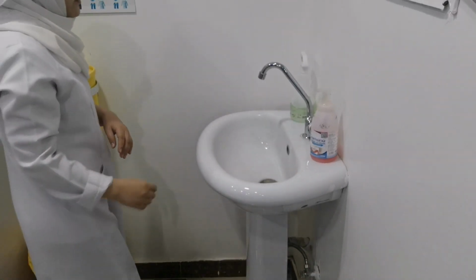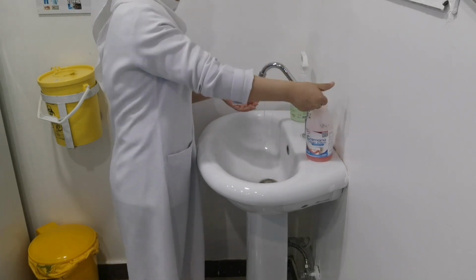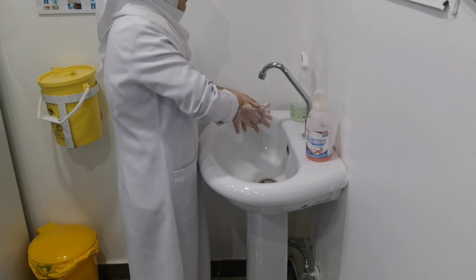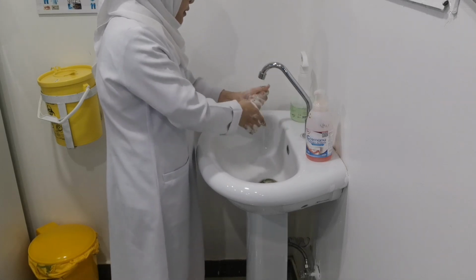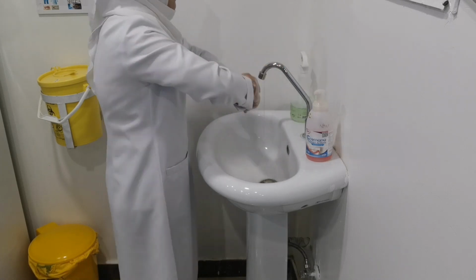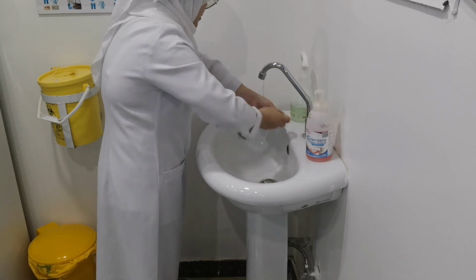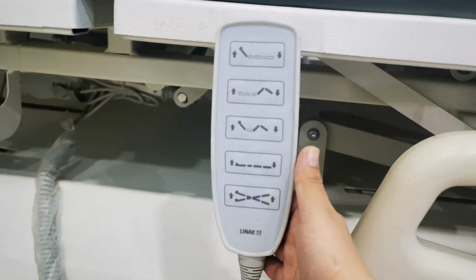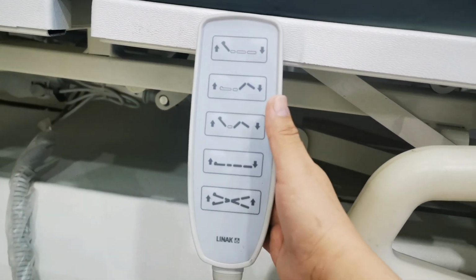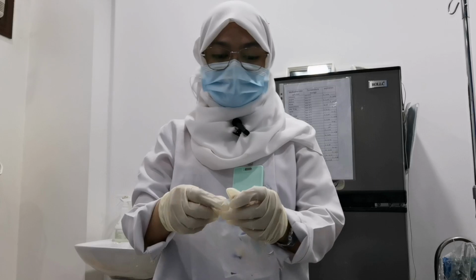And then we have to perform hand hygiene or hand washing. Adjust the patient's bed to a comfortable work level. I have to set up the IV set.